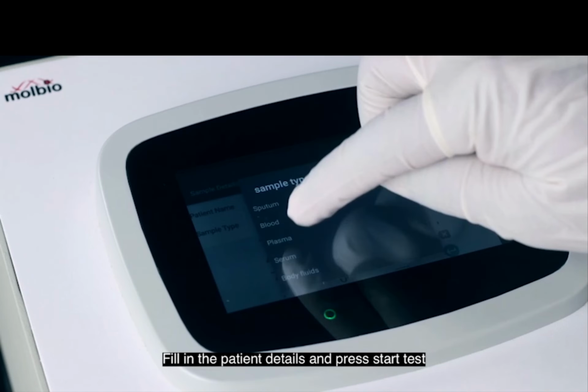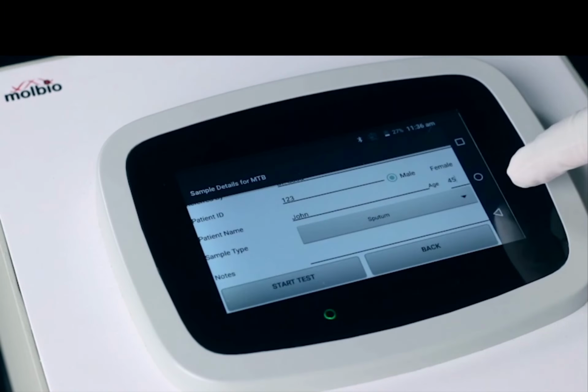Sample, which type of sample? Okay. Sputum sample. For TB, we are not using blood, so kindly please don't select blood. Why is that option there?